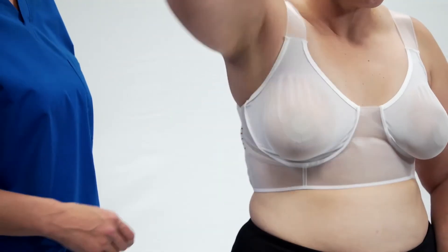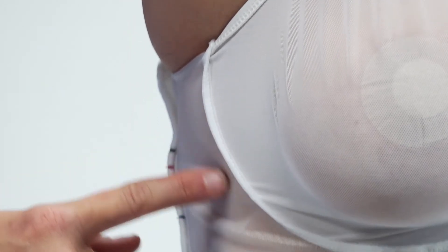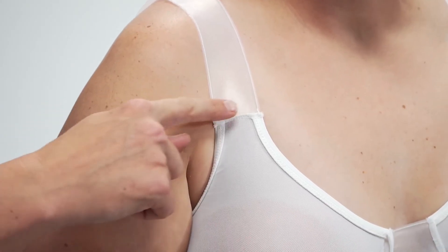Have your patient put the bra on to the best of her ability. You may notice the bra looks like it is inside out. For comfort and fit, seams are designed to be on the outside of the bra.